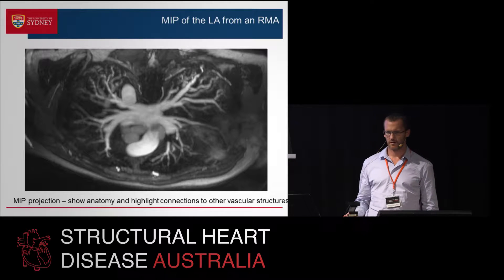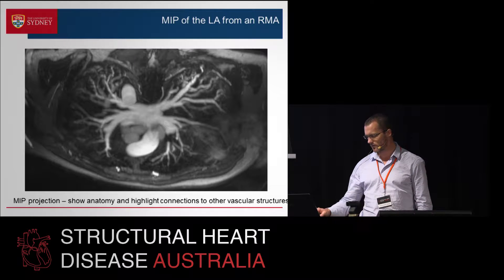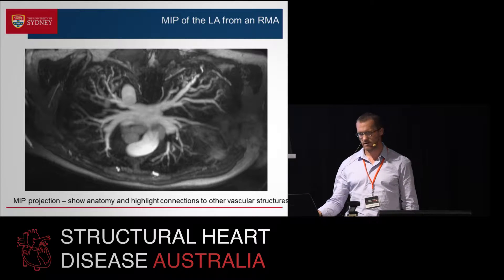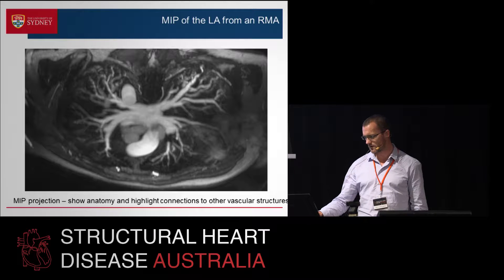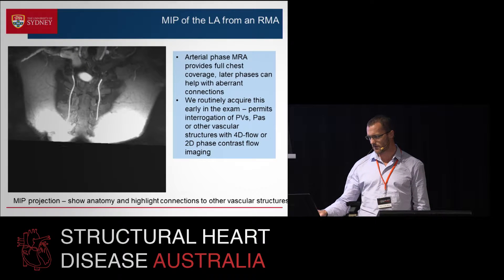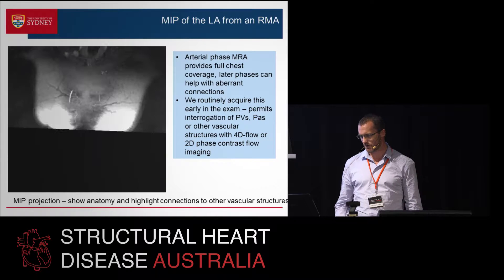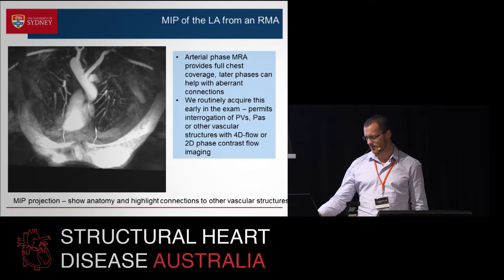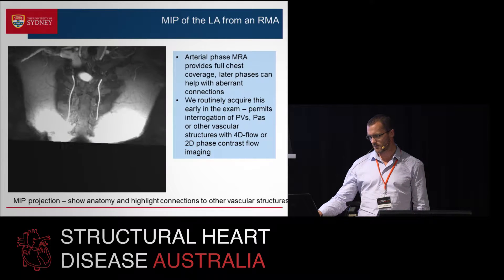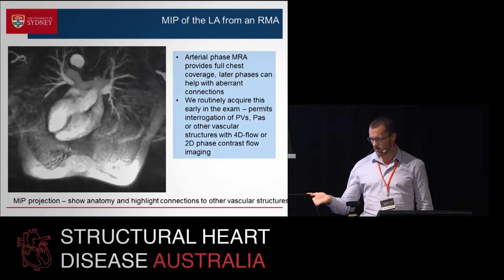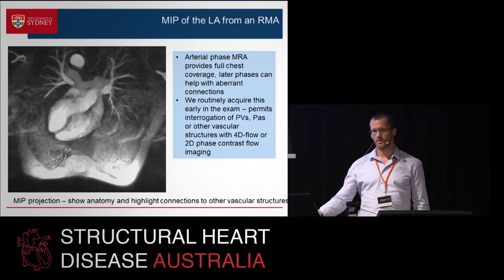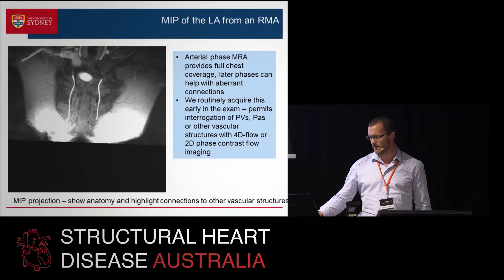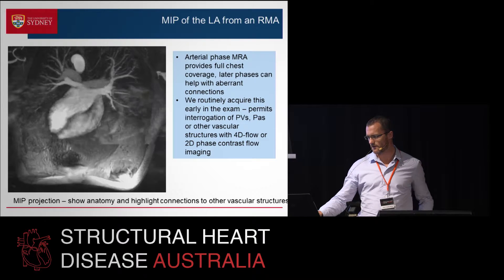Here's a MIP projection. I quite like these. Most radiologists do because in one view you can see all the connections, and any aberrant connections will pop out very quickly using that kind of method. Here we're just looking at a coronal view. MRAs are extremely useful. You get similar anatomical information to that which you can get using CT angiograms that are adequately timed.